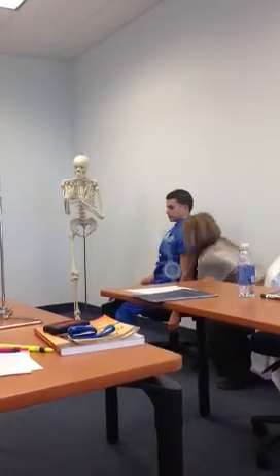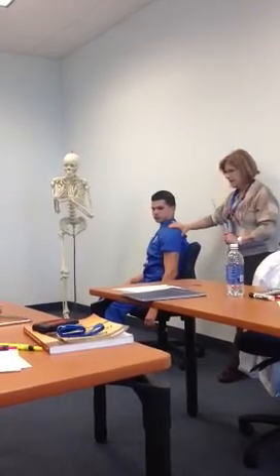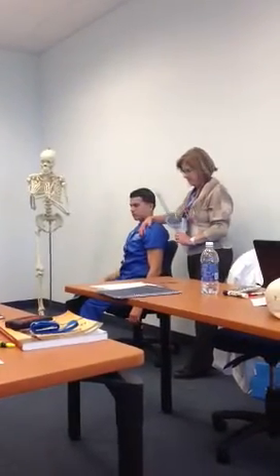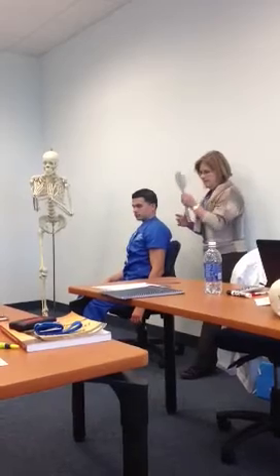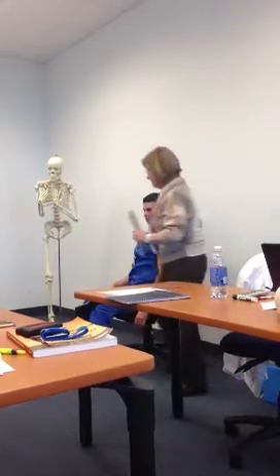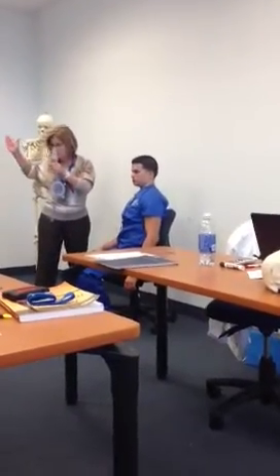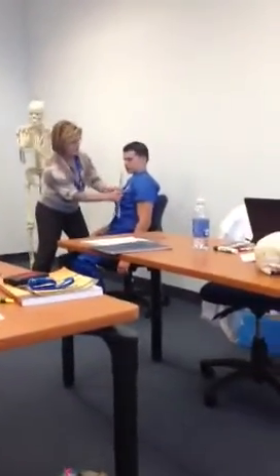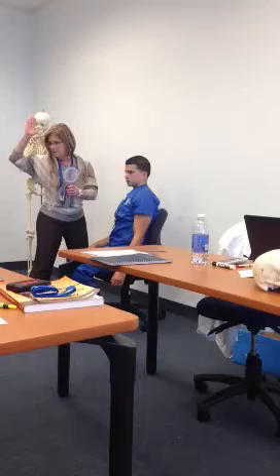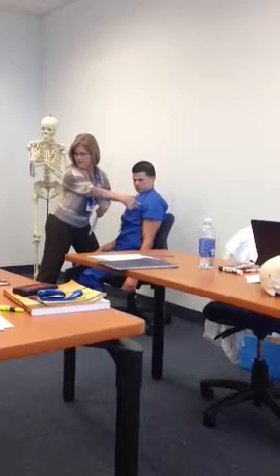Okay, but now, if I want to do ABD, there's 2 ways. I can place my goniometer right here at the joint, or right here in the front. Either way. Now, again, my non-movable arm is going to go parallel to the trunk, right? The trunk doesn't move. And this is going to be my movable arm, which is going to be running with this arm. The axis is going to be right where that joint is.